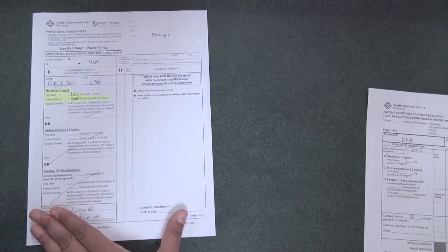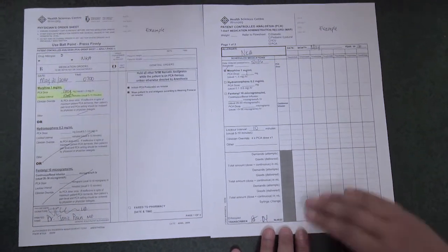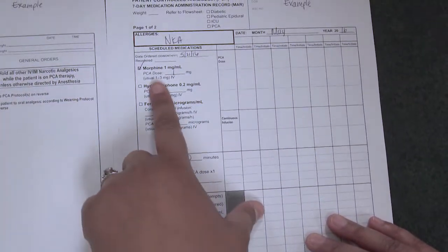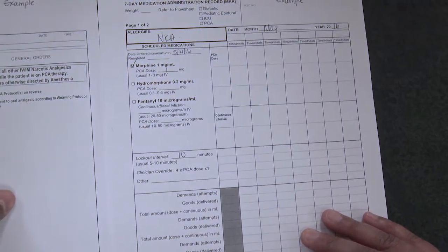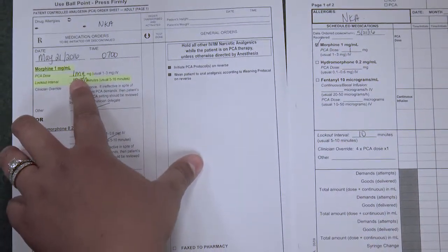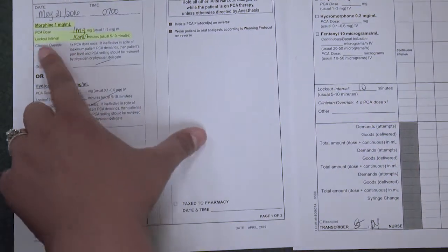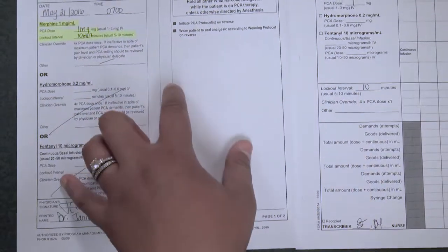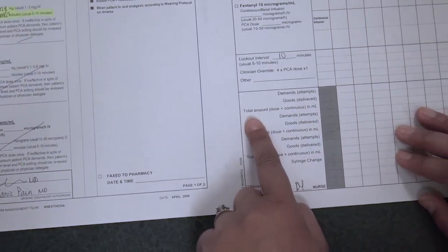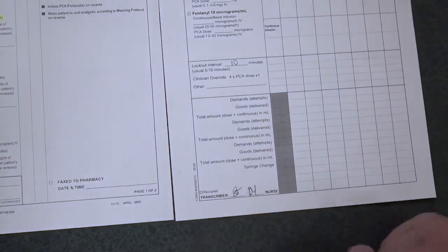Now that you've seen the physician's order, we're going to look at the MAR. It's a different MAR for a PCA. If this is a brand new order, you want to make sure that your MAR and your physician's order match. We've checked off morphine, because this is what we're going to be using. PCA dose is 1 milligram, PCA dose is 1 milligram. Then down here you have your lockout interval, 10 minutes, and your lockout interval here is 10 minutes, so they coincide. Then we have demands and goods, total amount dose plus continuous in milliliters, and syringe change. But we'll go over this more when we're programming the pump.